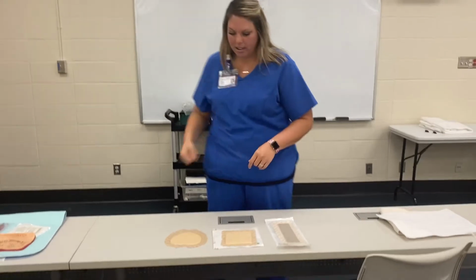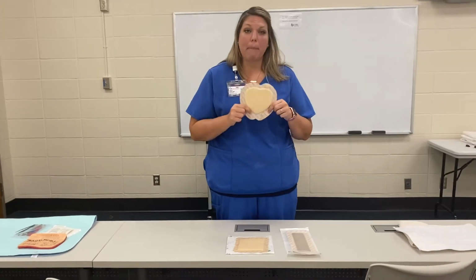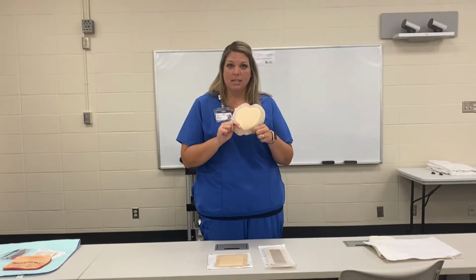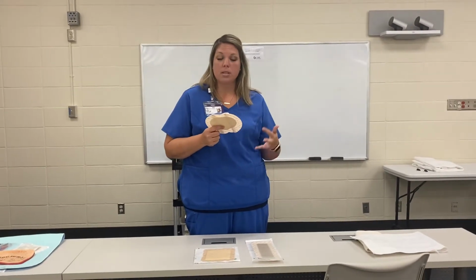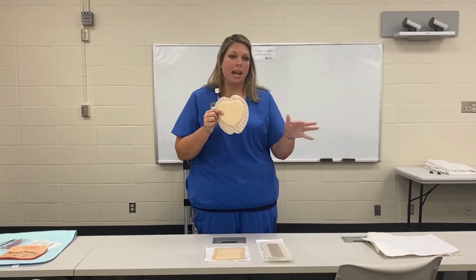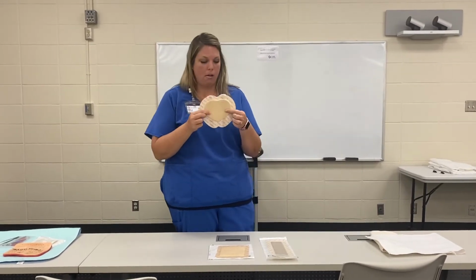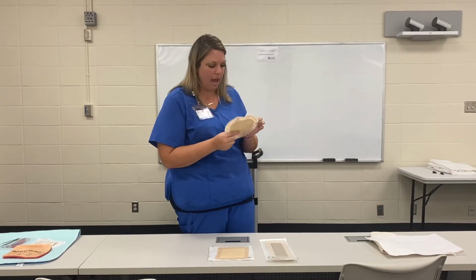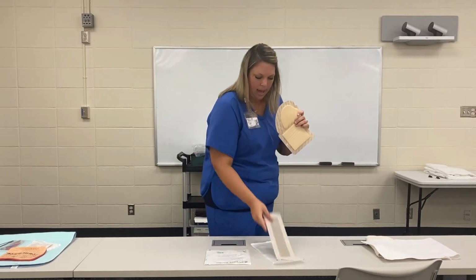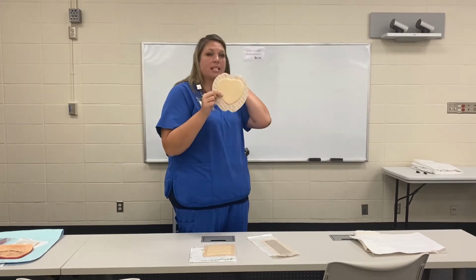The next thing we have for you to look at are some really cool devices or dressings we use called Mepilex dressings. Okay, so a nurse many years ago created these. She had worked with patients with wounds and tried to figure out a way to prevent pressure ulcers. She developed this. I'm sure now she lives on some nice fancy island somewhere, sipping her drink on the beach, because she made a lot of money. These are fabulous, okay? You'll see they come in different shapes and sizes. I have long ones, rectangular ones, square ones, and this one is actually for the sacral area.